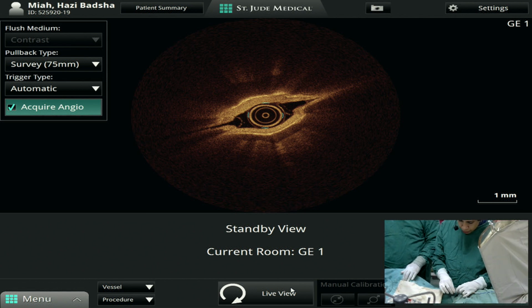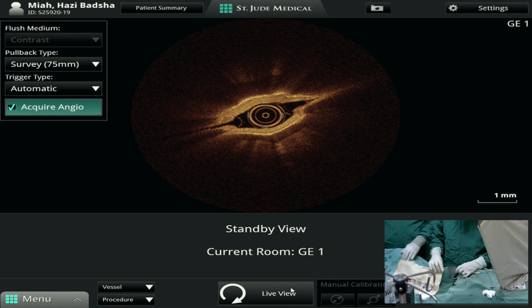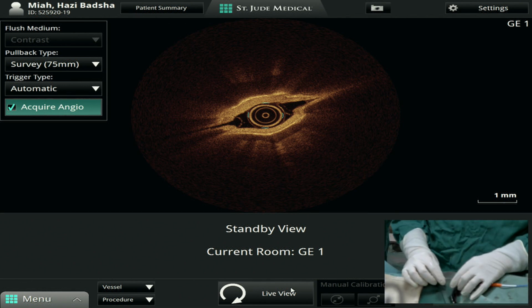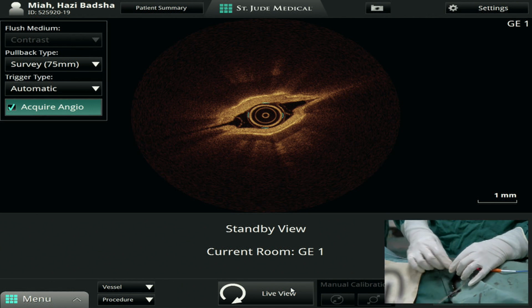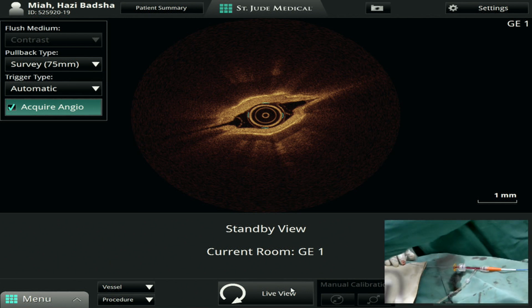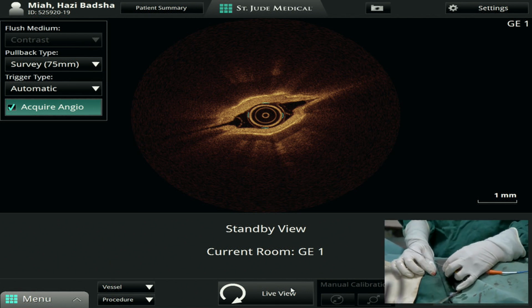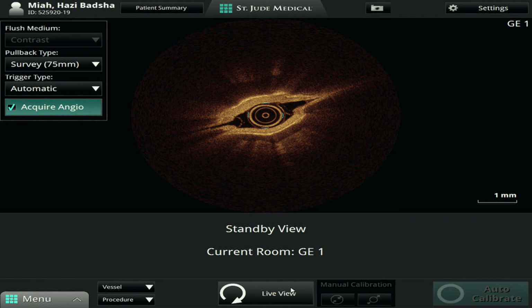So now we are putting this inside our catheter, and we need to be very careful. We don't want to kink it or anything, and it might kink if you're not gentle, and it would just be the end of this very expensive catheter. So we are trying to push it in, being as gentle as possible and taking short steps.